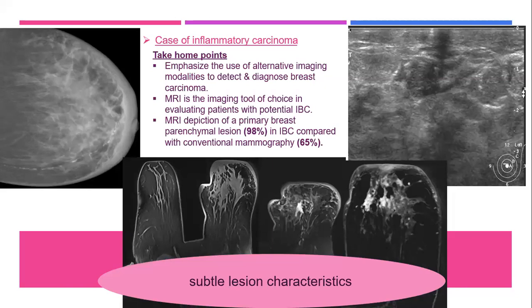Because usually inflammatory cancer presents as small infiltrative nodules, not a large mass or extensive calcifications. That's why it is not easily picked up on mammography.